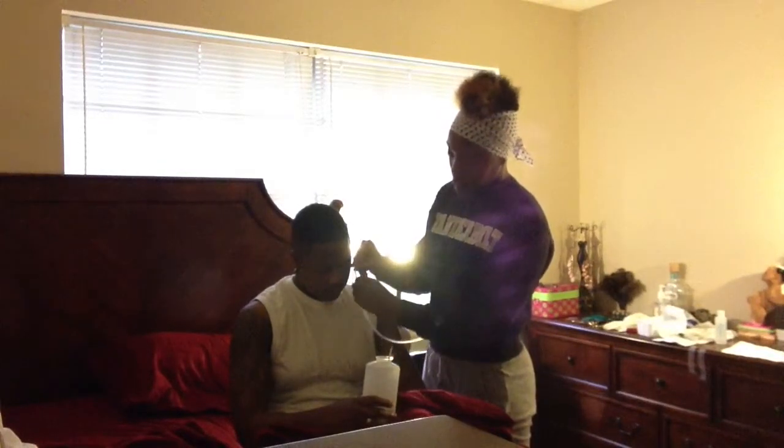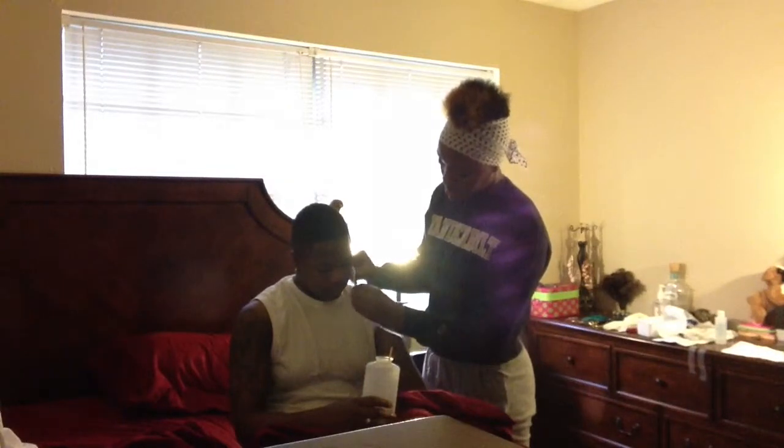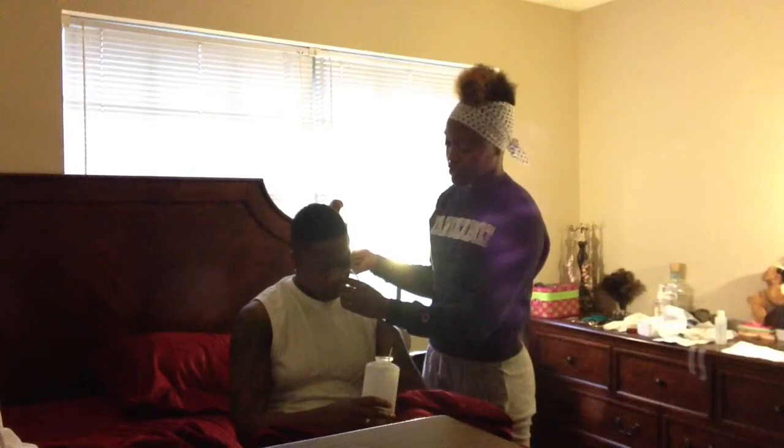And so I will continue to advance the tube until I get to the mark. If at any point Ruby started to experience any respiratory distress, I would immediately remove the tube. But everything seems to be fine. And so once I reach the mark, I want to secure the tube in place.